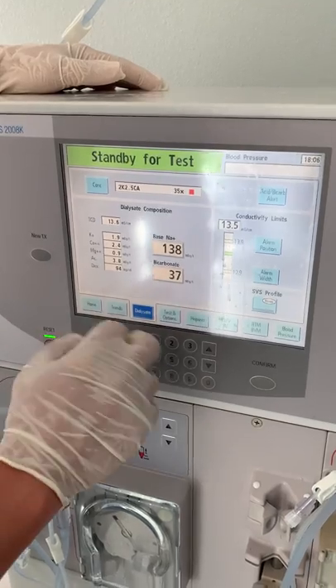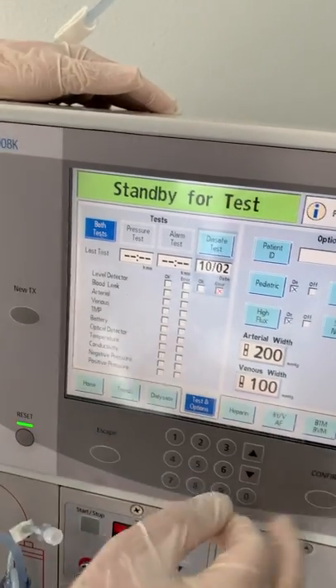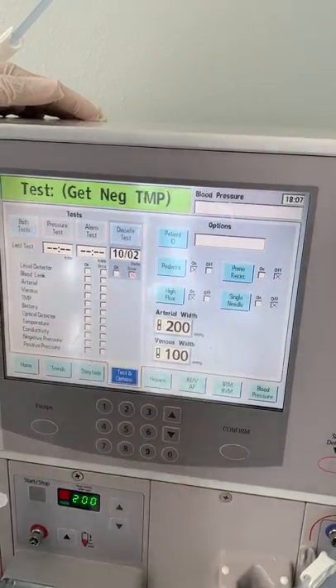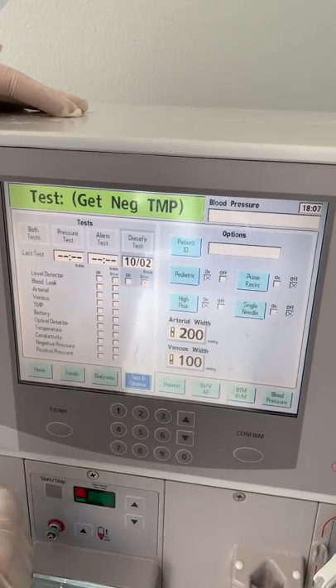To test it yourself, go to Test Options, then select Both Tests and hit Confirm. It will ask you to press Confirm Start, so hit Confirm. That is how you test your machine in the morning and every time you change shifts.